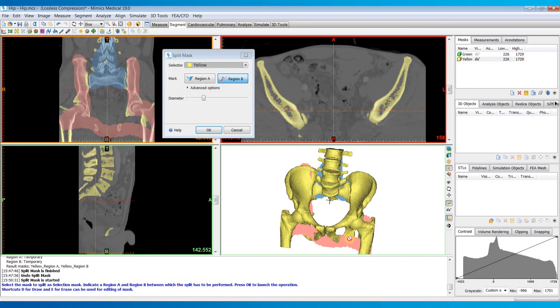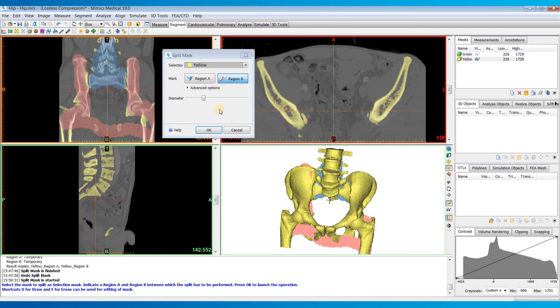You can see a preview of your markings here in the 3D window. It also usually helps if you mark the areas where they're connected or really close to each other — the tool will have a much better outcome typically.